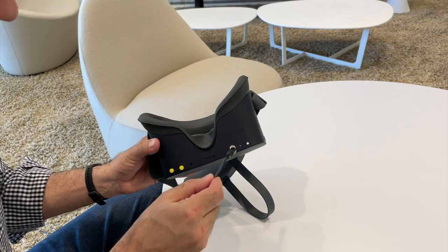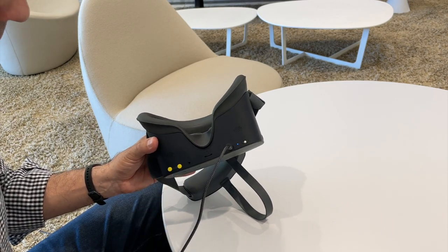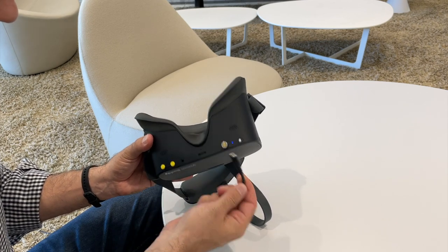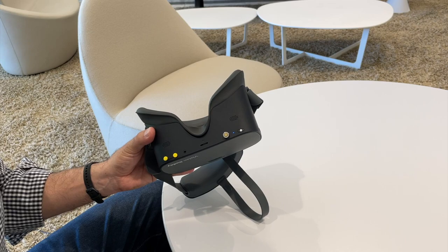When charging your headset, make sure the magnetic cable is fully connected in order to work. When removing the magnetic cable, it is important that you gently pull sideways instead of outward.